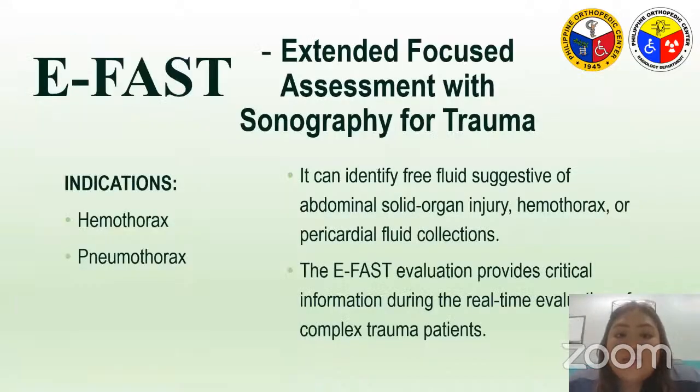Now, EFAST means Extended Focused Assessment with Sonography for Trauma. The protocol is just the same, except that we added the lungs in the examination. The EFAST evaluation provides critical information during the real-time evaluation of complex trauma patients. It can identify free fluid suggestive of abdominal solid organ injury, hemothorax, or pericardial fluid collections. The common indications are hemothorax and pneumothorax.